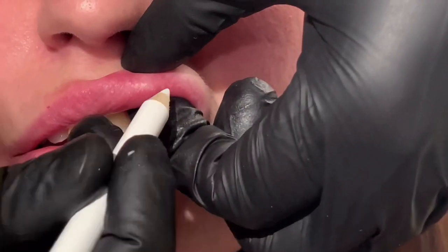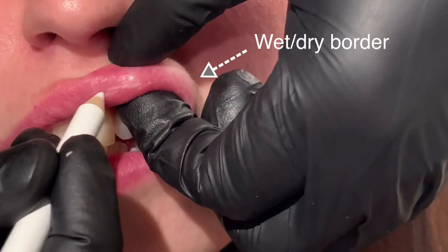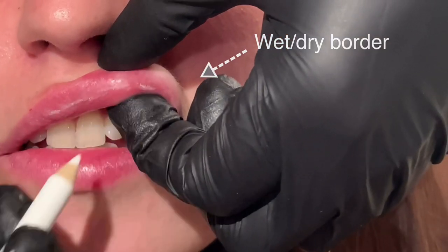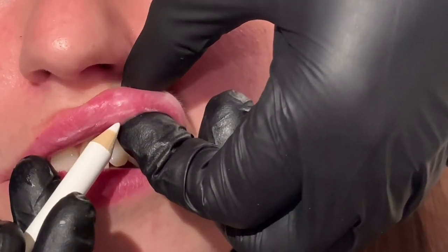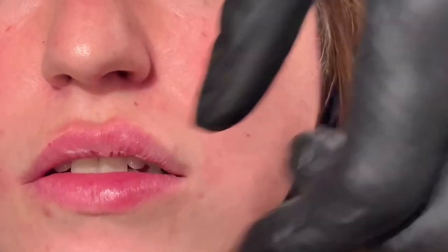The line I'm drawing here represents the wet-dry border. 97% of the time your artery lies just underneath it, but there's still that 3% margin. So place your product up here, never down there, and you might want to consider a cannula. Stay safe.